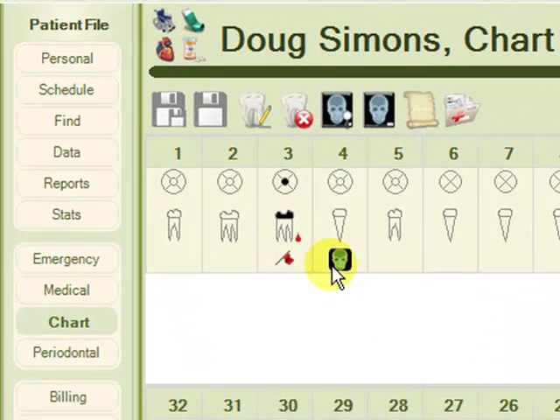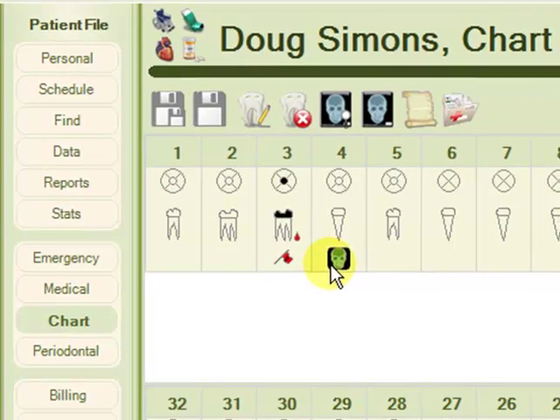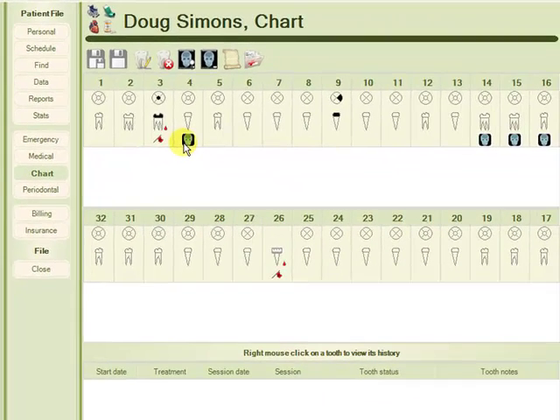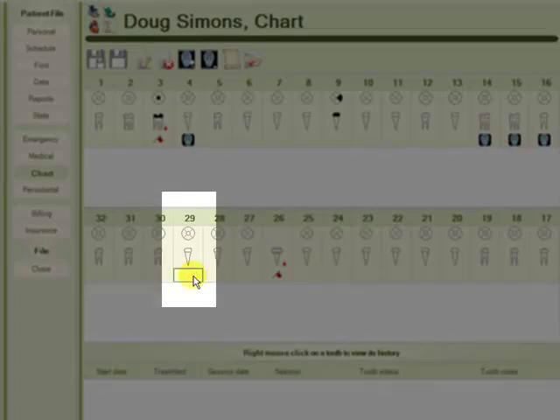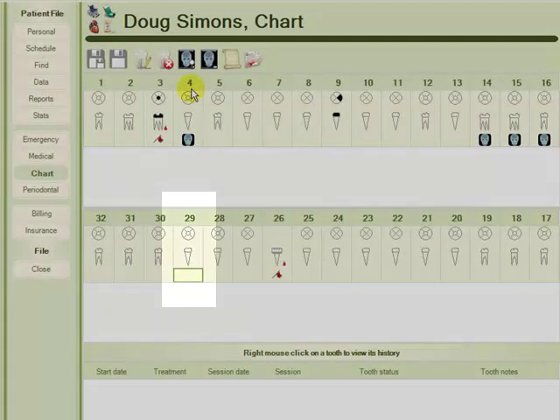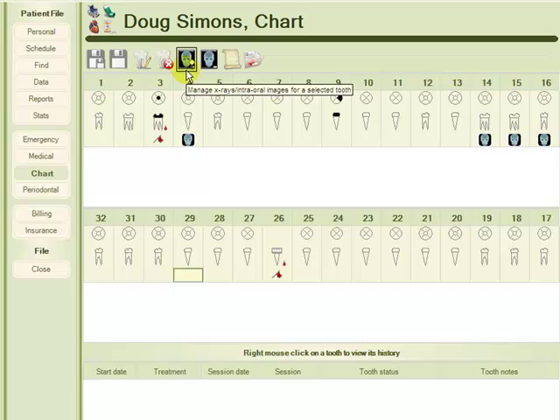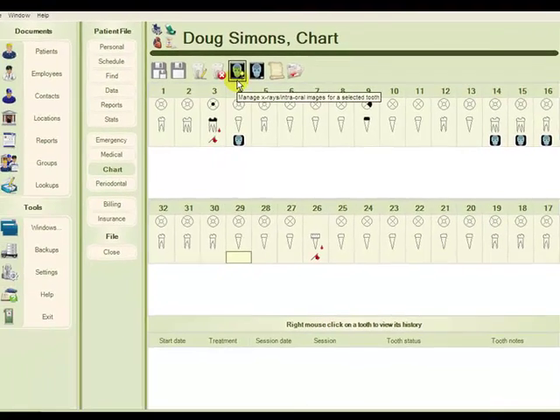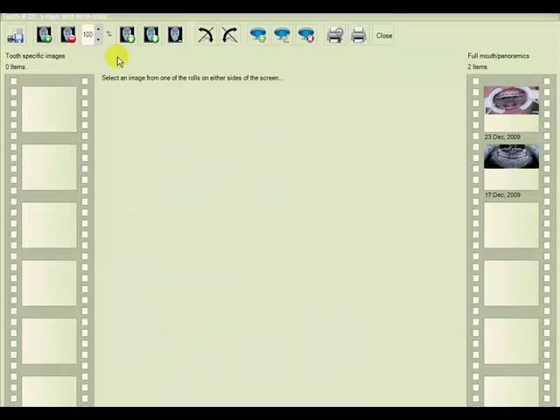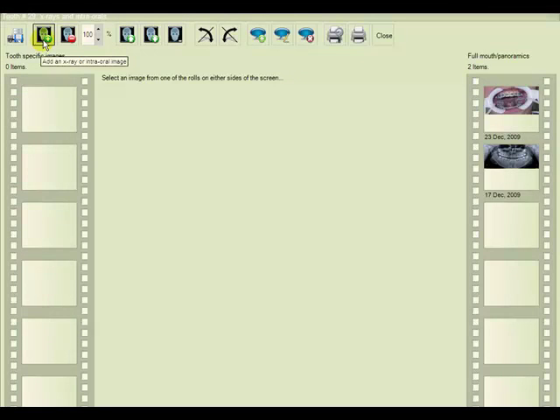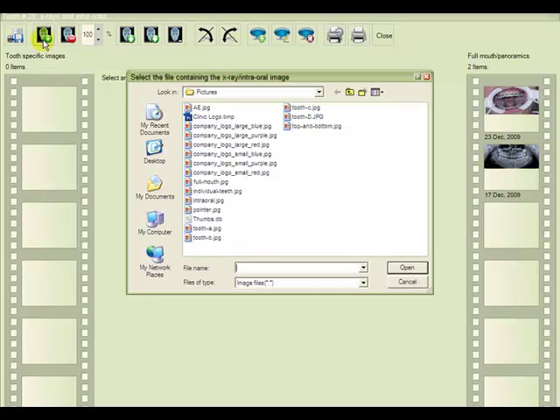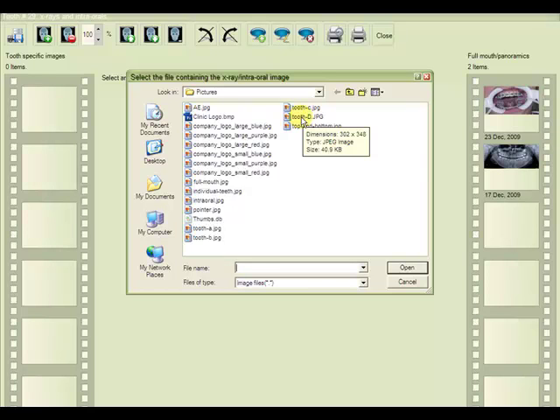To add an X-ray or other image to a tooth, we choose the tooth and from the top toolbar choose manage X-rays for selected tooth. From the film strip toolbar, we'll choose add an X-ray or intraoral image, and we'll choose the image file from our local or network drive and open it.